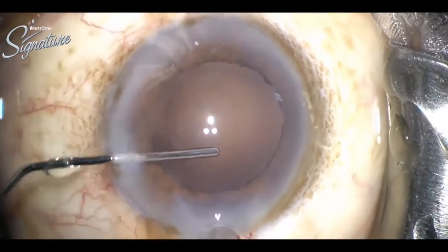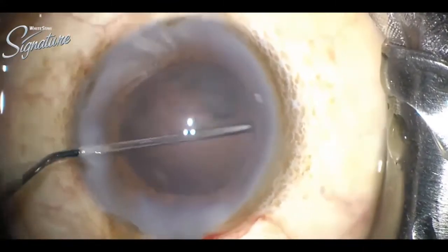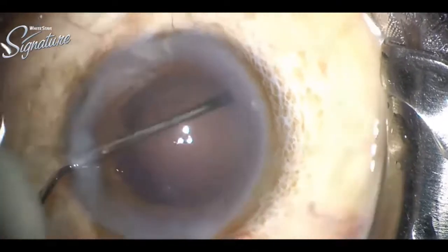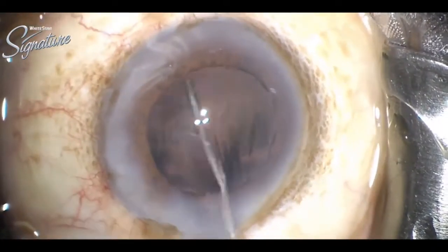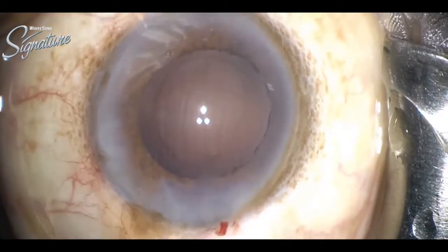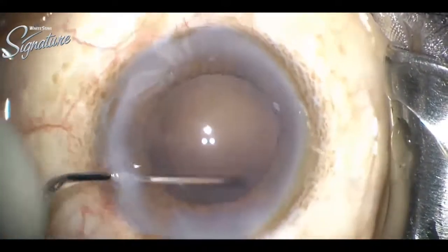Polishing is done with a 27-gauge cannula. You can see it is a very centered capsulorrhexis, almost 6mm.